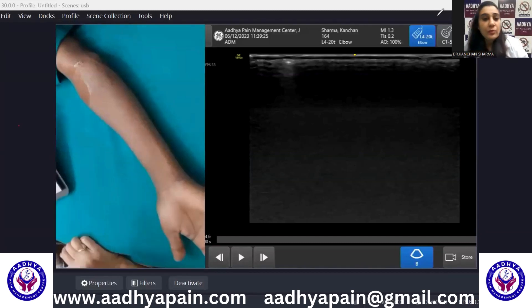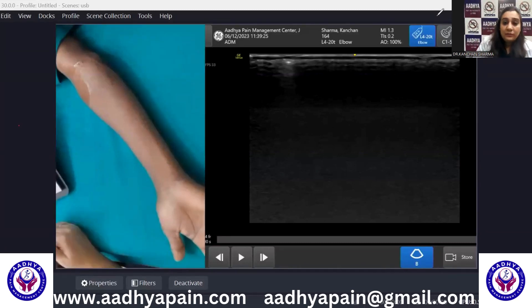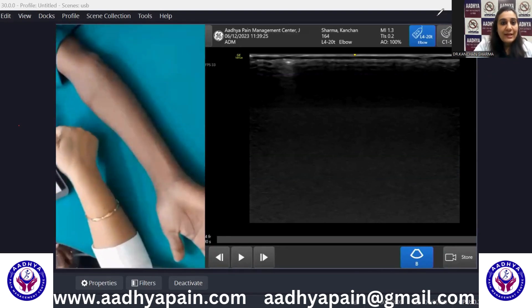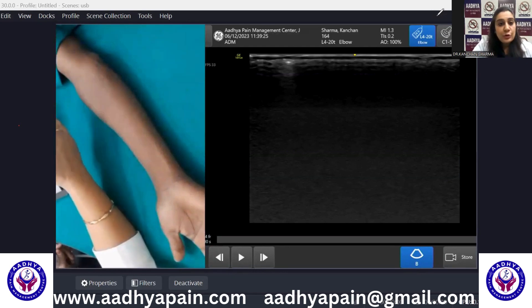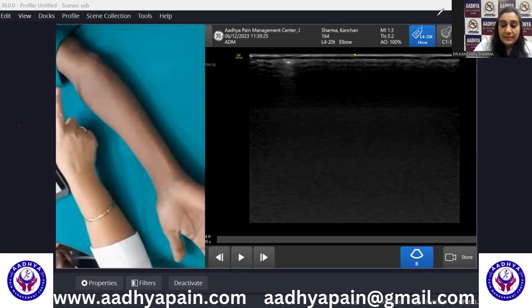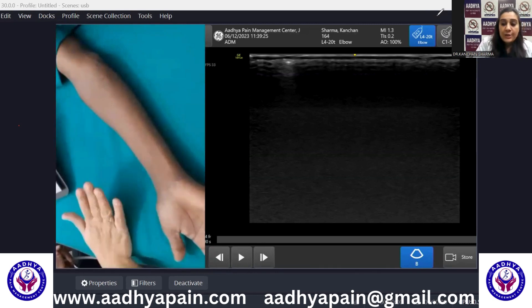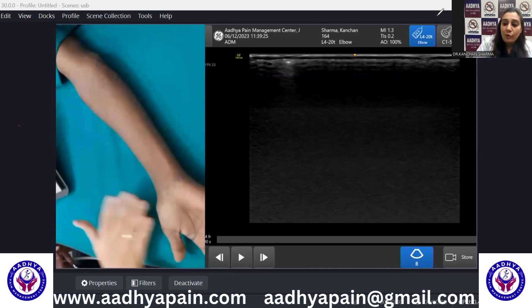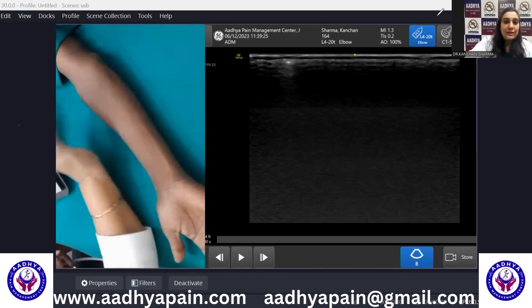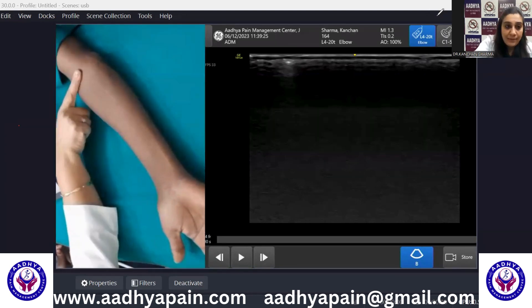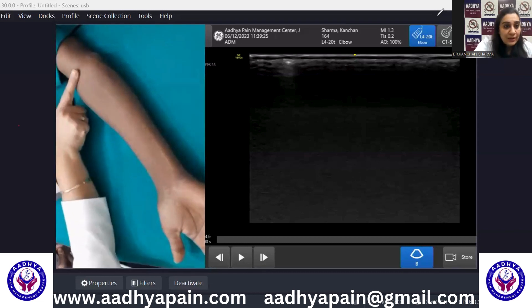Now let's see the demonstration. To scan the anterior elbow, the patient sits across the table with the shoulder in forward flexion, elbow extended, forearm supinated, and palm facing up. You can start scanning from below and come up, or start from above and come down to the distal end of the humerus.